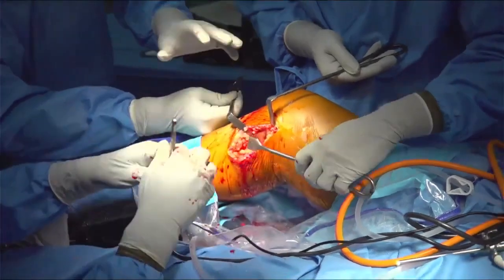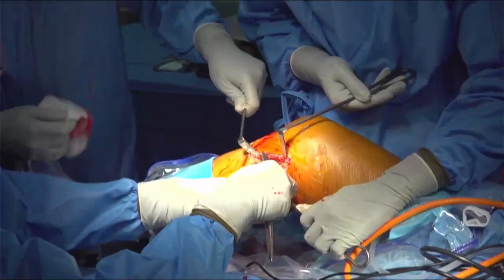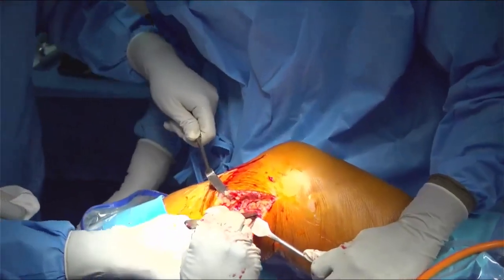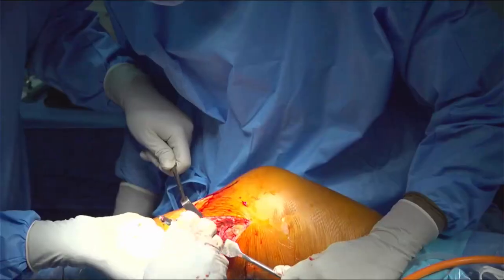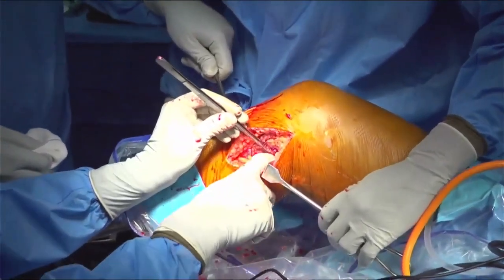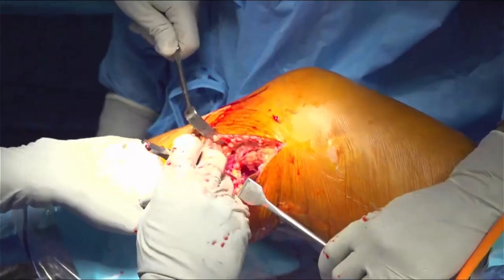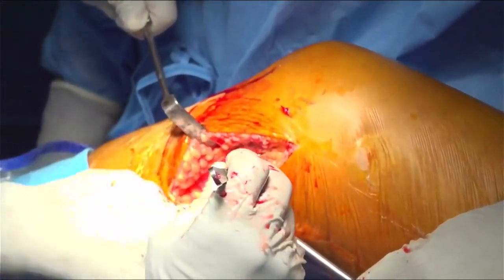Knife then. So this is one layer of the MCL we are talking about.